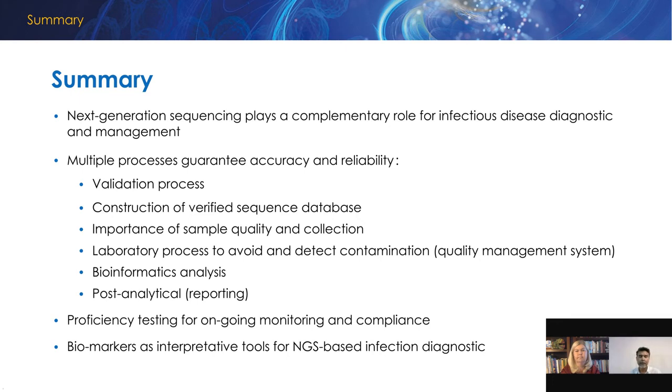16S, as a sequencing based on ribosomal RNA, requires amplification. This is a targeted NGS. They amplify this ribosomal gene from bacteria and fungi. During the process of amplification, some variation of the PCR can be developed, and targeted primers can be introduced to target RNA viruses. But for the sequencing itself, the genes that are targeted are only bacteria, mycobacteria, and fungi. So it's not possible to identify RNA viruses using 16S.